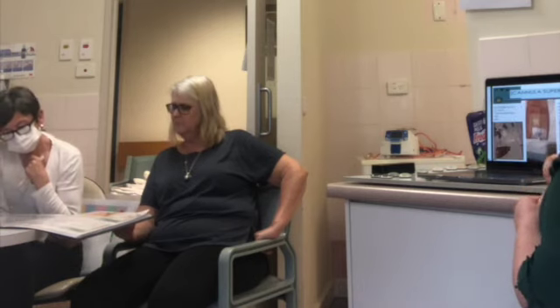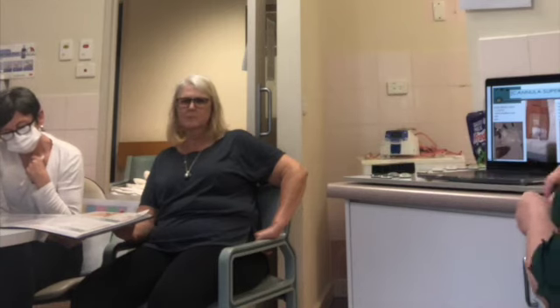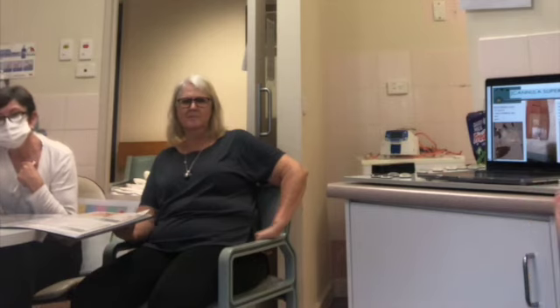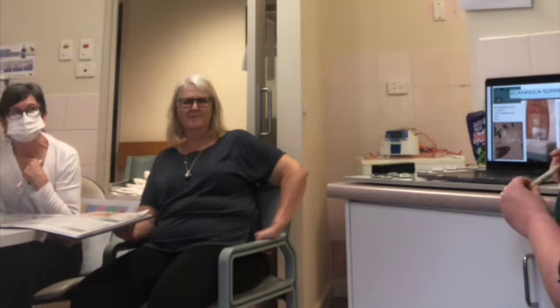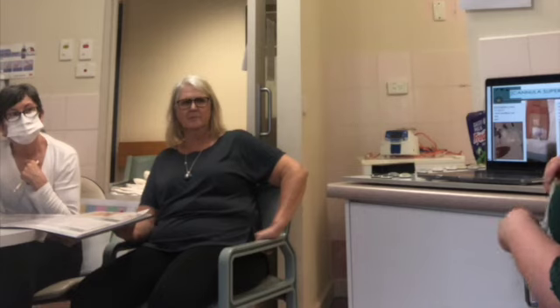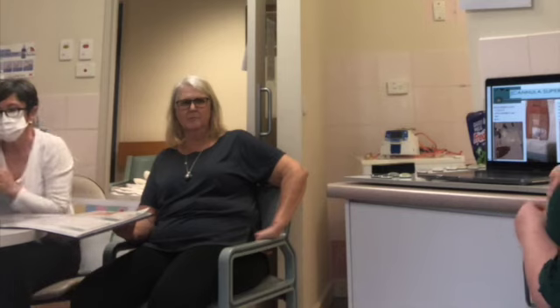I just want to run through a little activity where I've got these foam simulators, and someone can come up and use Jeffrey, my phlebotomy arm. He's new and I'm so proud of him. He's a bit rough to cannulate. I think he might be a bit too rough for people that are learning. Basically I want you to show me how you change a cannula dressing. One person pull the dressing off without pulling the cannula out, and another person put on the dressing and talk through why they're doing it like that.